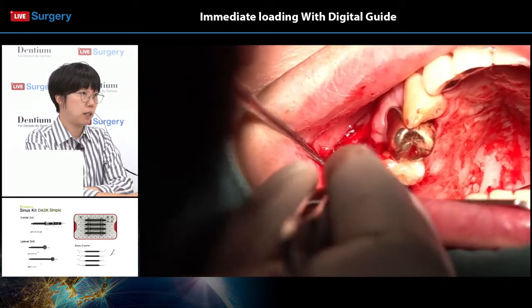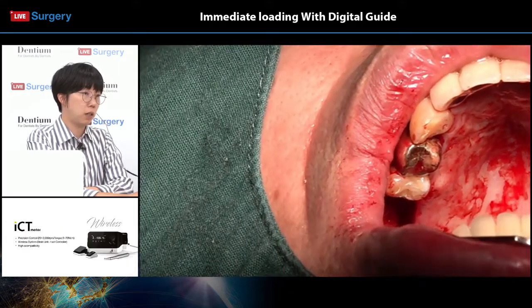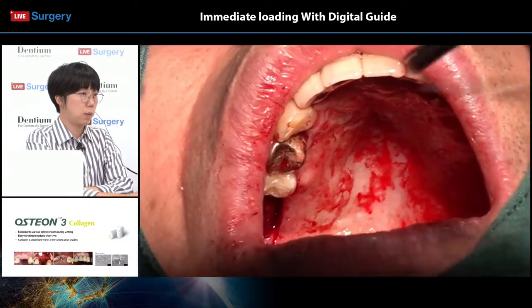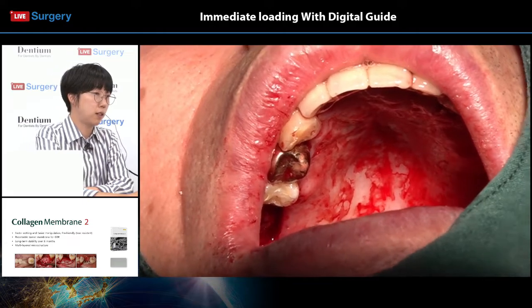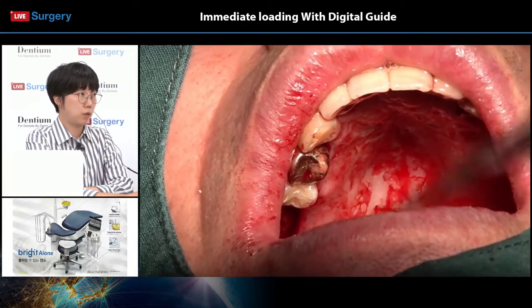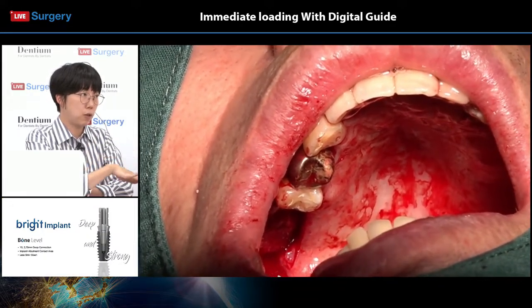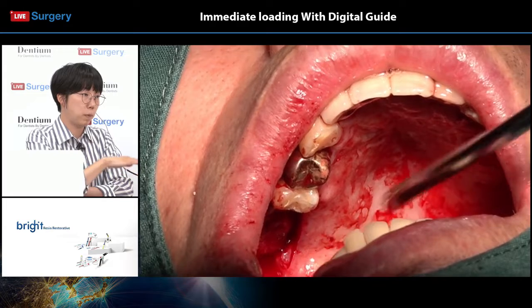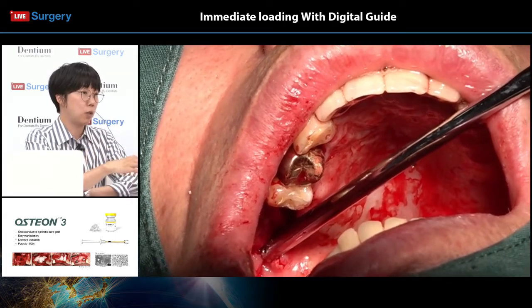He's now placing the membrane into the buccal flap. Like many moderators of Dentium seminar have mentioned, when performing bone graft surgery, please make sure you position your membranes into the flap first. Always membrane first, because when the membranes become wet, they sort of flap around. They're hard to secure in position, so it's always important to place your membranes first and then add bone graft material under the membrane. Otherwise, if you have bone graft material first and try to put the membranes over the graft material and under the flap, that would be a hard thing to do.